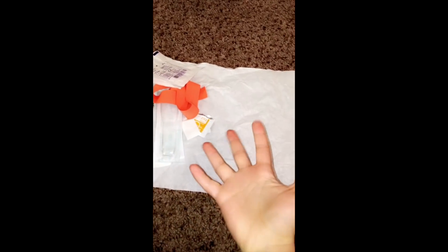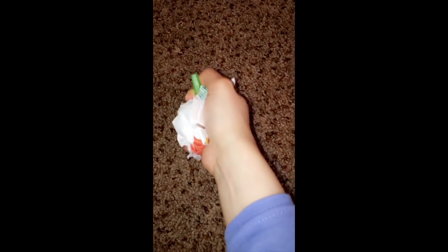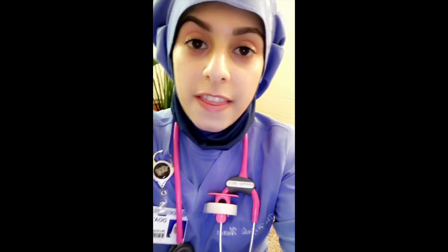Then for the rest of this stuff — you would have your gloves on at this point. What would happen is you would grab everything with your gloved hand and then take the glove off by slipping it down your wrist over your entire fist so that all of these things become enclosed in the glove. Then you throw the glove away, you tell the patient have a nice day, and then you pat yourself on the back because you're an amazing nurse, phlebotomist, or doctor. I hope you guys found that informative. That's phlebotomy for you — amazing stuff.